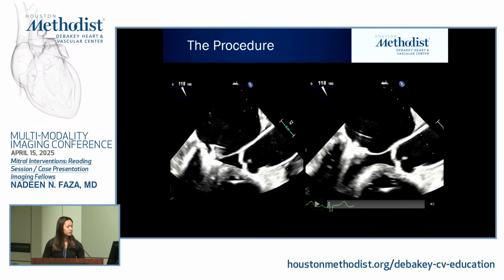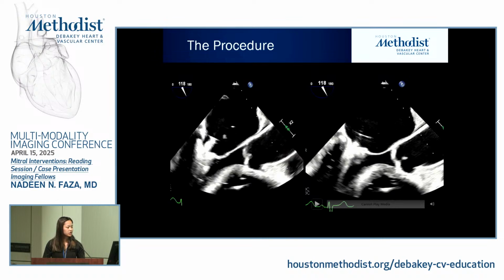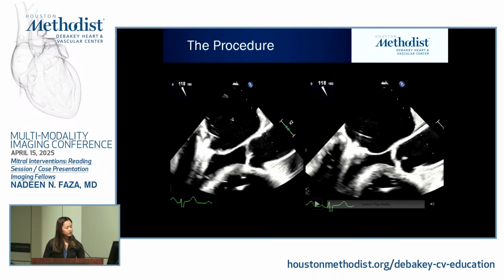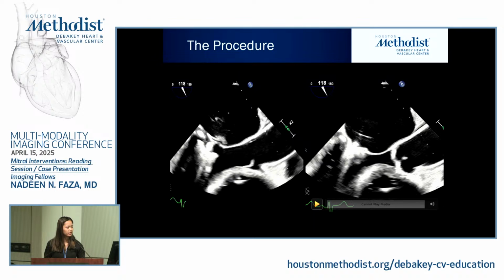Like Dr. Little mentioned, we were very careful in making sure that the orientation is what we wanted, and we double checked the orientation again, repositioned, and crossed. On the left side is where we find that the arm is the longest, and we pull back the device and capture both of the leaflets.